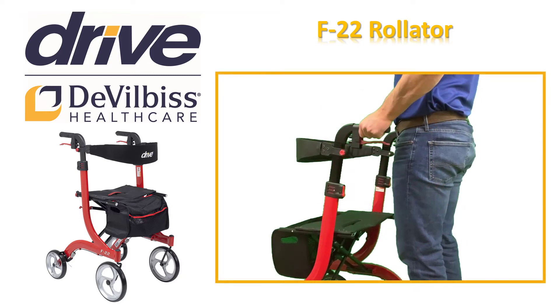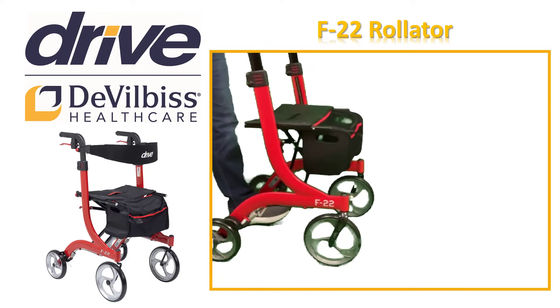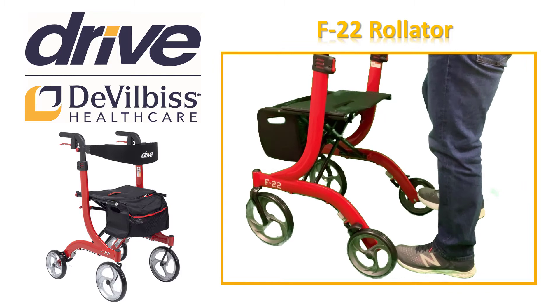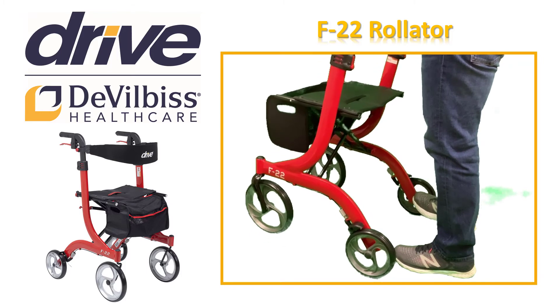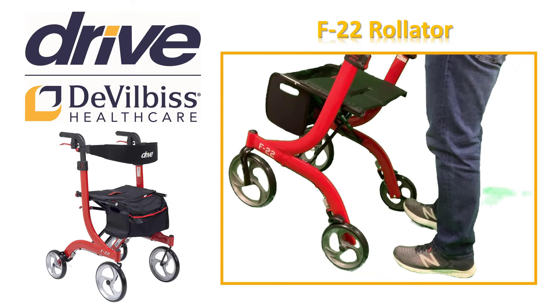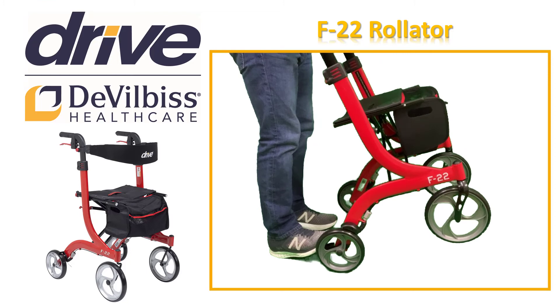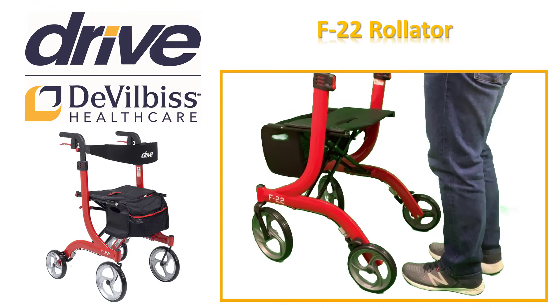When approaching a curb, step, or transition, firmly grasp both hand grips and place your right foot on the curb hopper located on the lower right-hand side of the Rollator. Use your right foot to activate the curb hopper. Do not use your opposite foot. While securely grasping both hand grips, gently apply pressure to the curb hopper with your right foot. Bring the front wheels of the Rollator to a slight angled position just above the curb or step, pushing forward if necessary. Once at a stable position, gently release your foot from the curb hopper allowing the front wheels to rest on the curb, step, or transition.